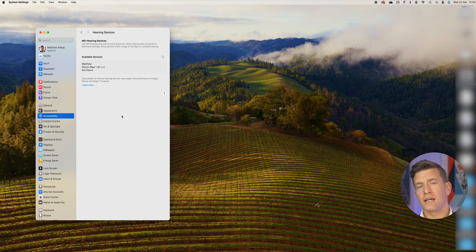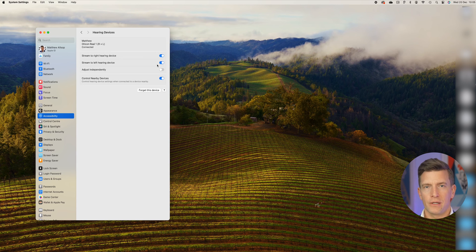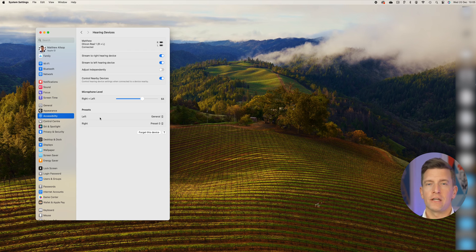You'll see an R for your right hearing aid, L for your left hearing aid, and an R plus L if you wear a pair of hearing aids. When your complete setup has appeared, move your mouse over the hearing aids and a box saying Connect should also appear. Press Connect. You'll only need to do this once, as after they're paired, your hearing devices will automatically reconnect to your Mac whenever they're switched on and in range.